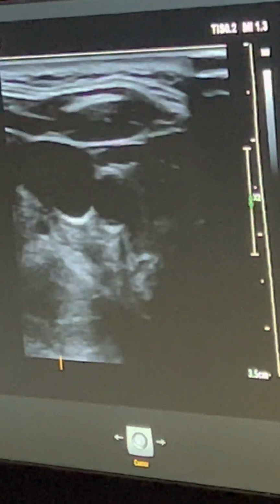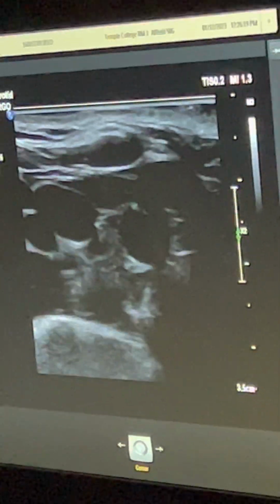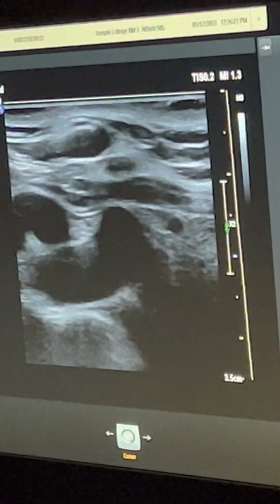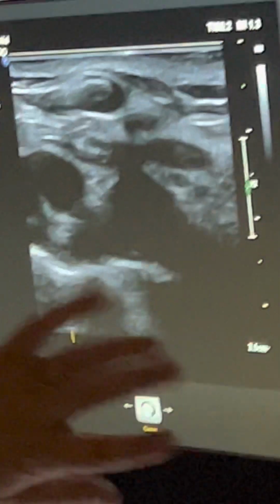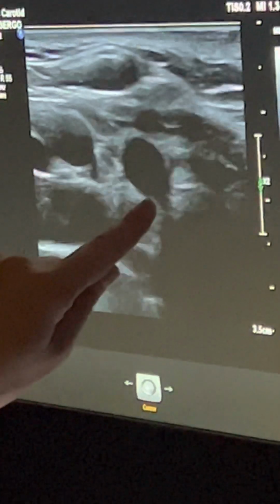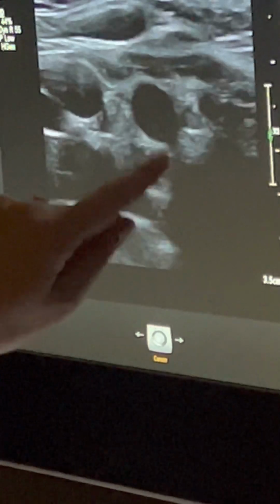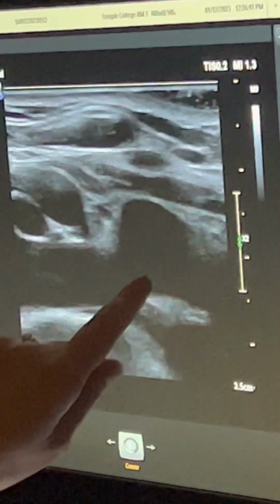All right, so common carotid. I know y'all haven't really learned the anatomy just yet, but just follow along with me. I'm angling down inferiorly towards her collarbone. Clavicle, right? You'll get this later on, but brachiocephalic is as proximal as you can get coming off that vessel. See that, guys? See where it goes and dumps into it? That's a takeoff right there.